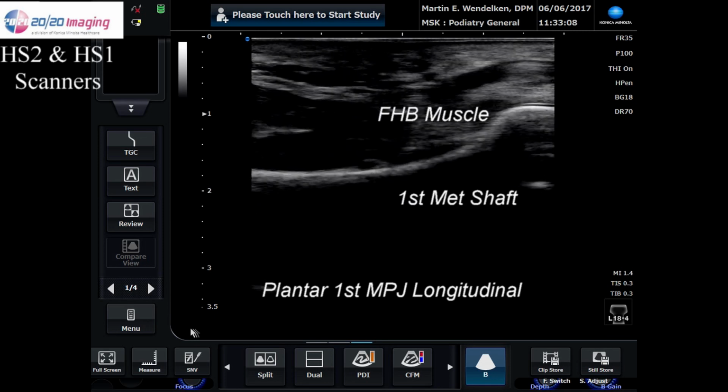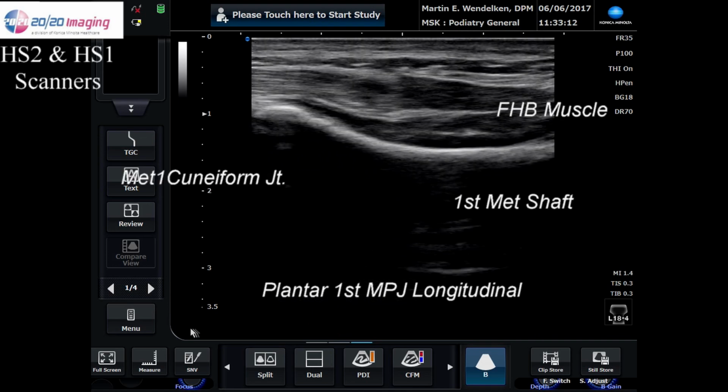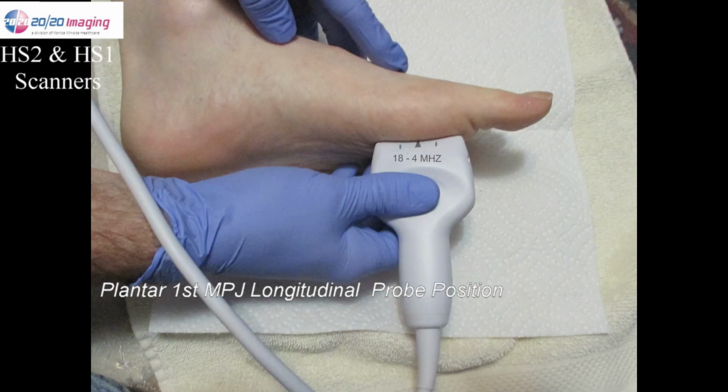In this case, you're observing the metatarsal shaft. As you see, I'm going proximal. There's the flexor hallucis brevis muscle. There's the metatarsocuneiform joint. This is the view actually that you're seeing on the plantar aspect.